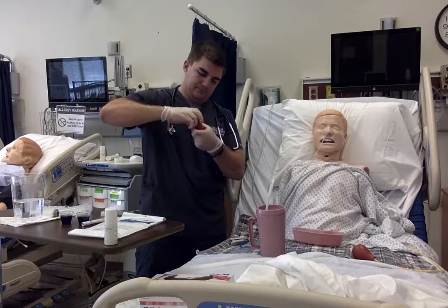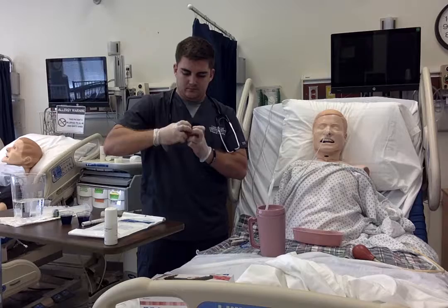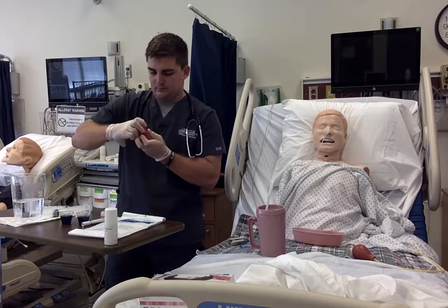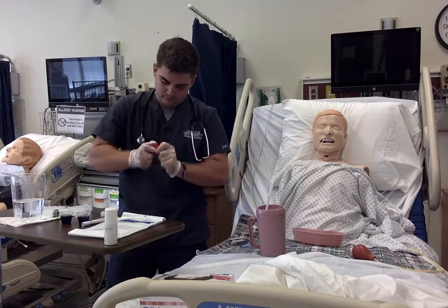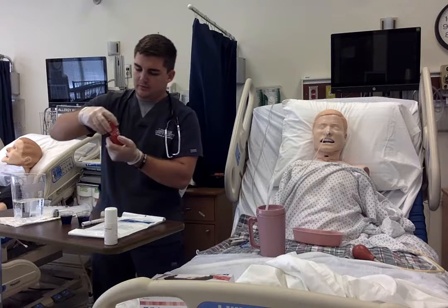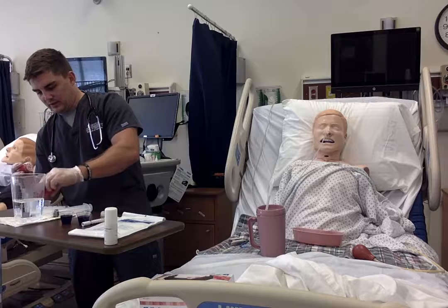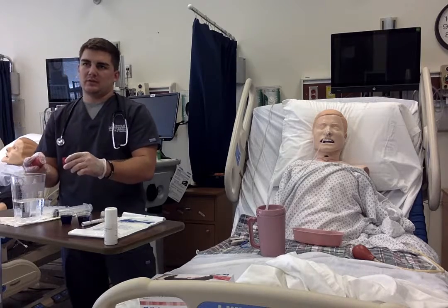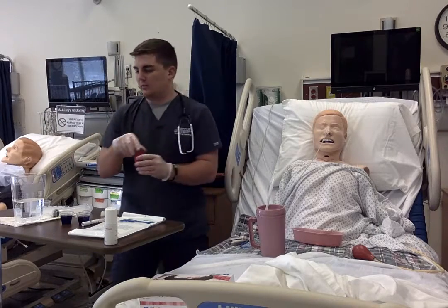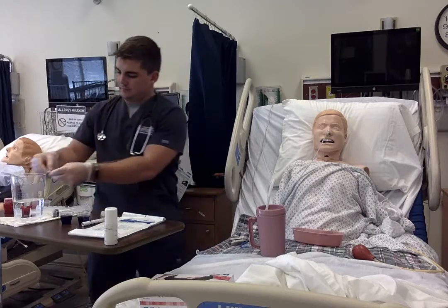Crushing it. Once it is crushed properly, I can put it in a container or a cup, putting 10 to 20 mils, or 20 to 30 mils, of water into the cup and letting it dissolve, and then doing the next one with the other two.